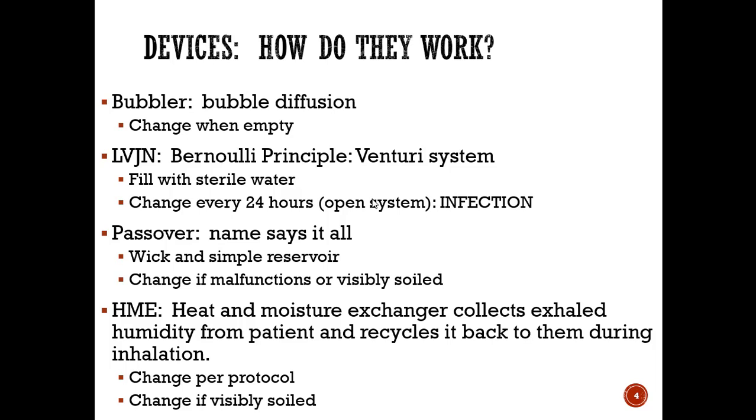These we use for our short-term vent patients that don't have any contraindications, which we're going to talk about some of those a little bit later. And these we would change per hospital protocol or if they're visibly soiled.